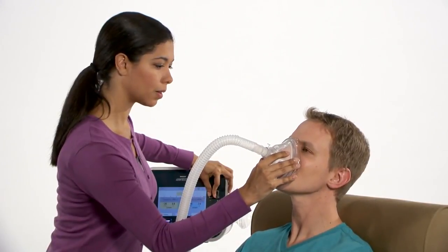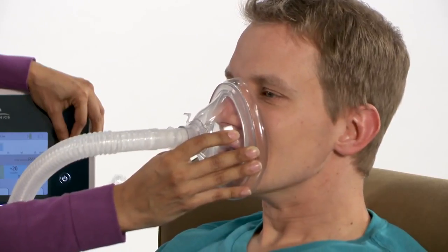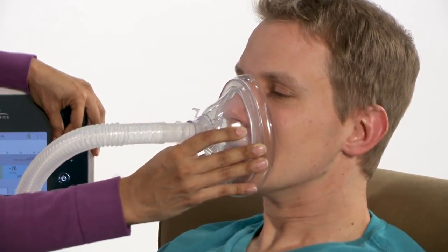By simulating a natural cough, CoughAssist T70 is an effective, comfortable way to help clear the airway.